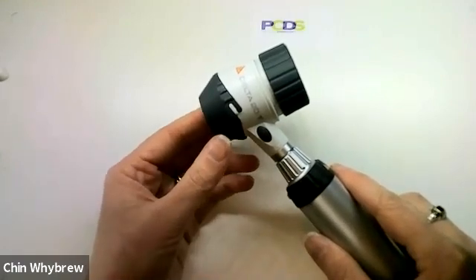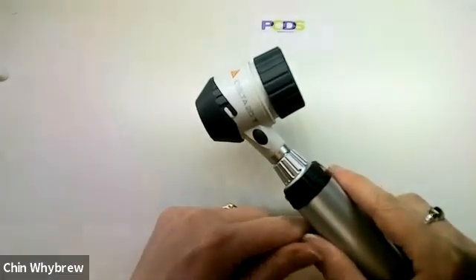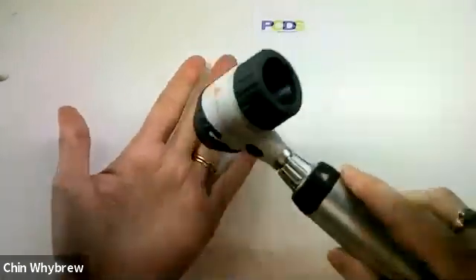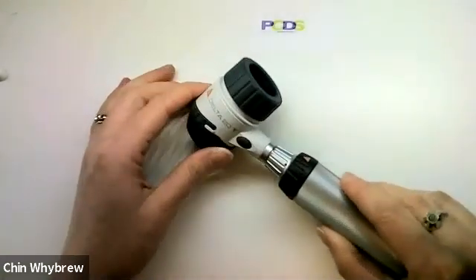The Heine Delta 20T does not have disposable end plates to go with it, and it has a relatively small field of view. Having said that, it's a good enough size for most things that you're going to want to use it for.